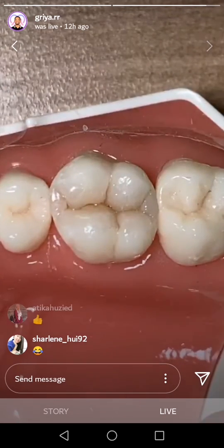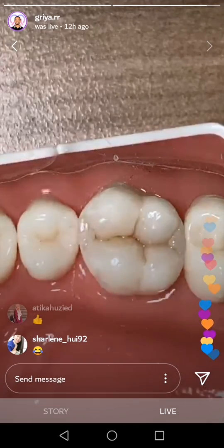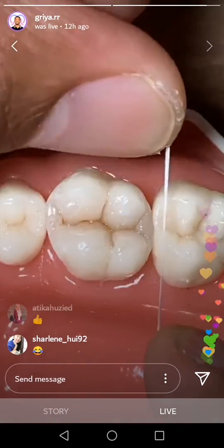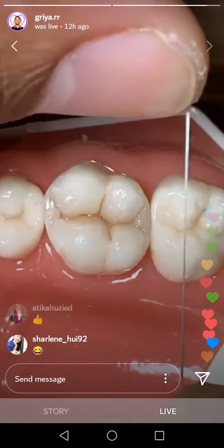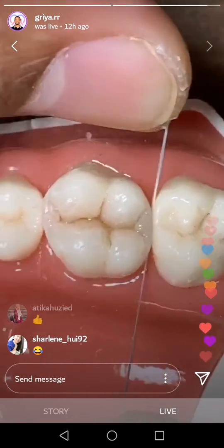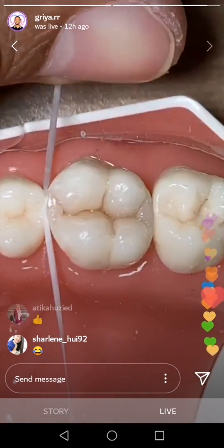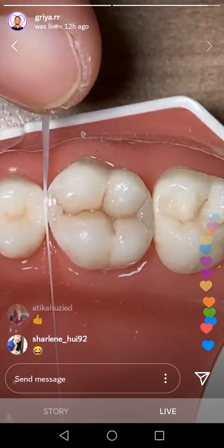So that's it for today. So let's turn on the comment, and okay, check first with this, yeah. Okay, this is dental floss. Let's see. Oh, very nice. See the contact. Ooh. Okay, and this one. Ooh. See. Ooh.